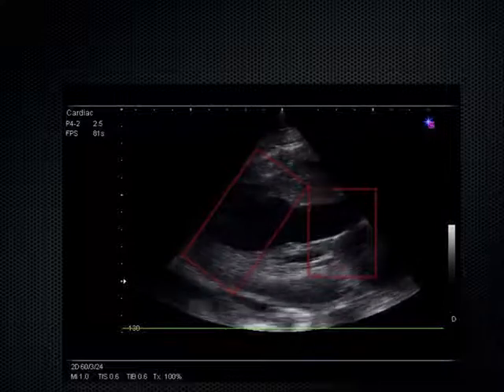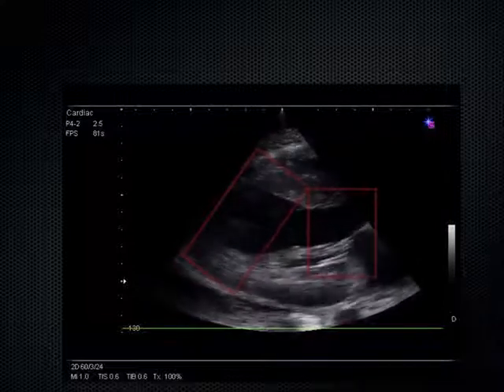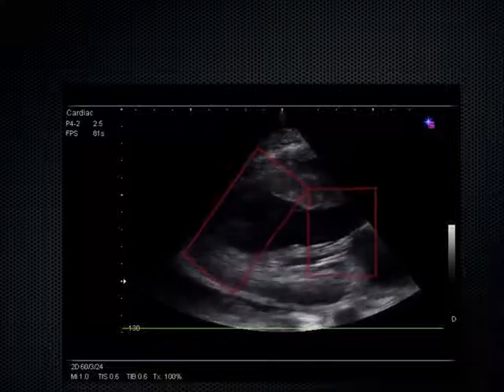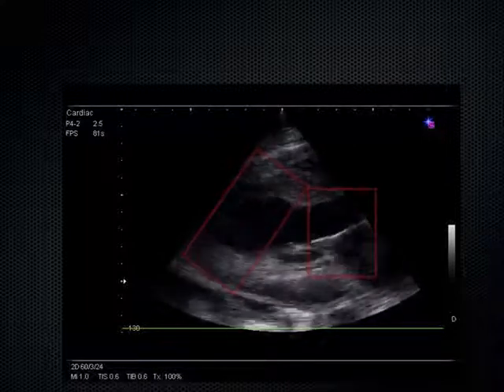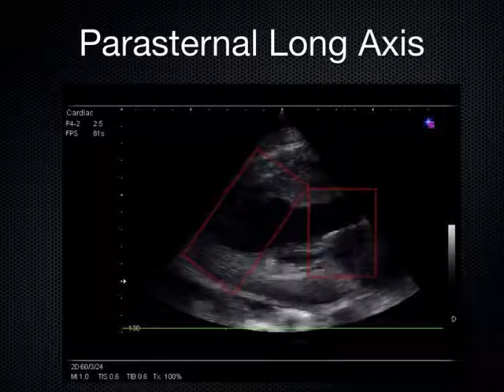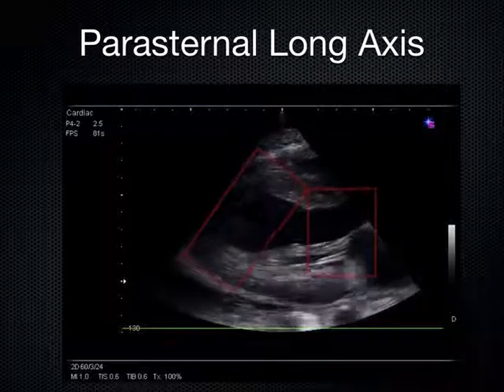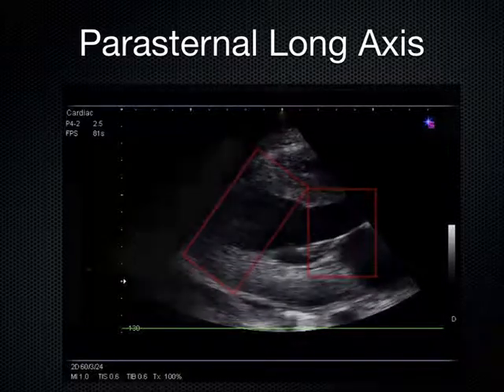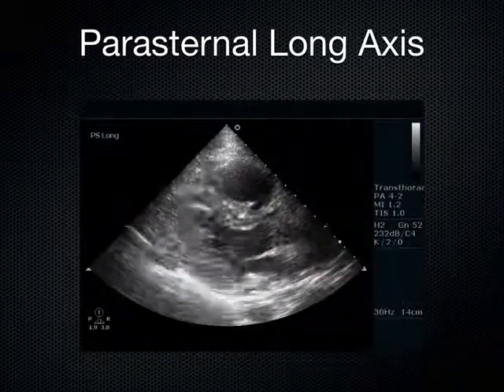Because when the nurse comes to you and says, hey, this patient's hypotensive, we've got to resuscitate this guy, how much fluid should I give him? That's their first question to you. So you just have to be very careful that you don't just start dumping fluids into a heart that looks like this. That's why, anytime anybody's hypotensive, I immediately go to the bedside and take a look at their heart, and then I make a decision about whether or not to give fluids at that point.